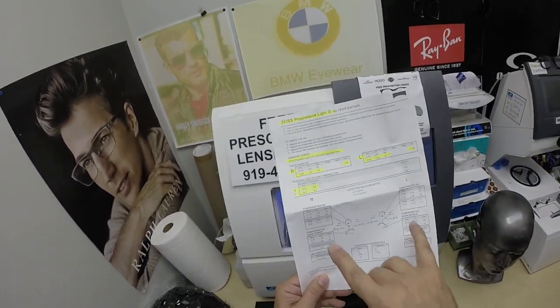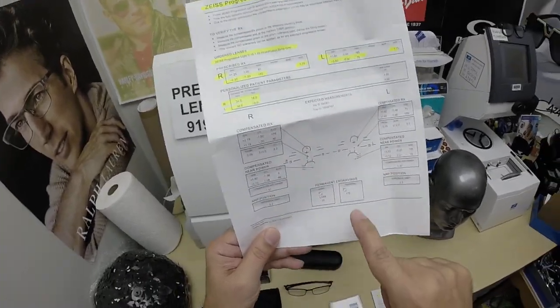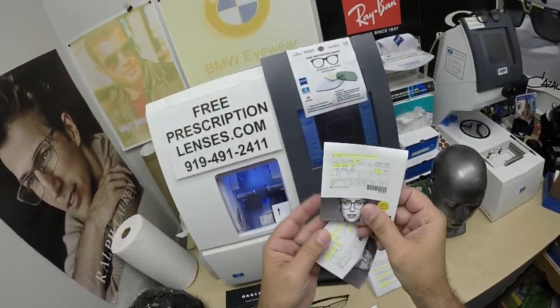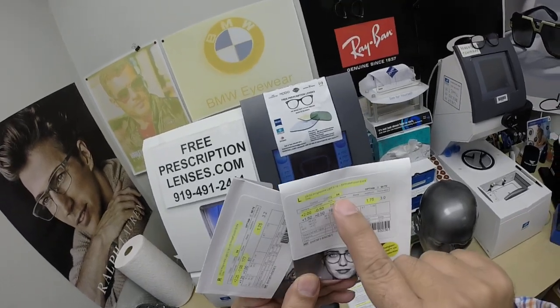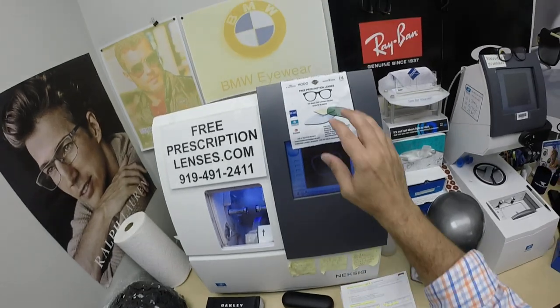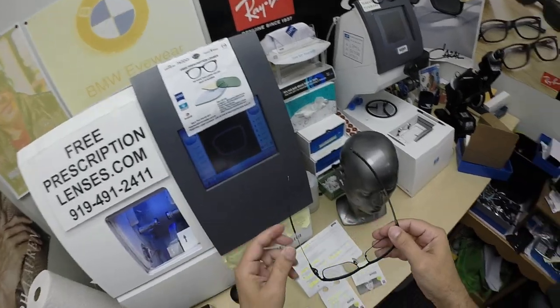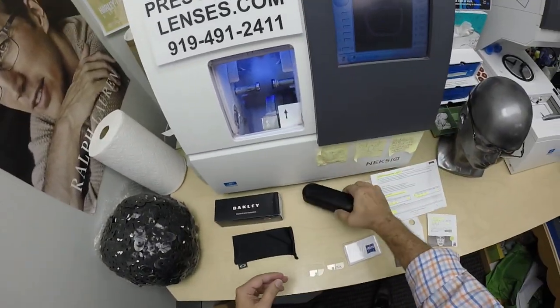Being a digital freeform lens, you get Zeiss's mathematical compensated formulas for distance, intermediate, and near, as well as the laser engravings and the packets the lenses came in — you get all the original manufacturing documentation. DS stands for DuraVision Silver. You get the Zeiss cleaning cloth, my premier microfiber cleaning cloth, and instructions on how to care for the frame and lenses so they last you for years, as well as instructions for all three cleaning cloths and the case.